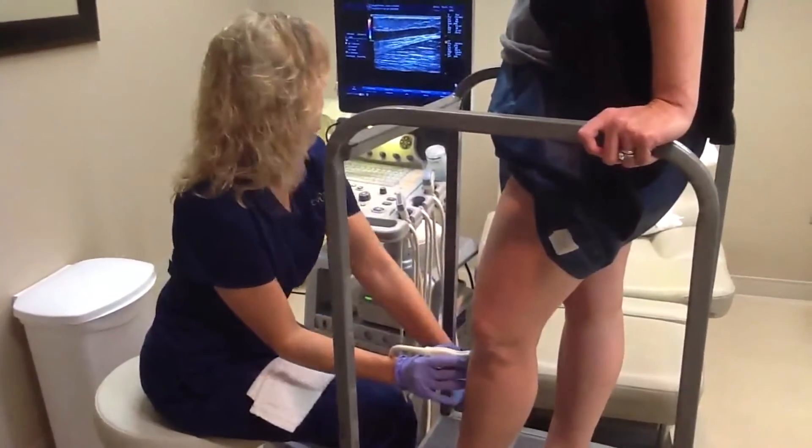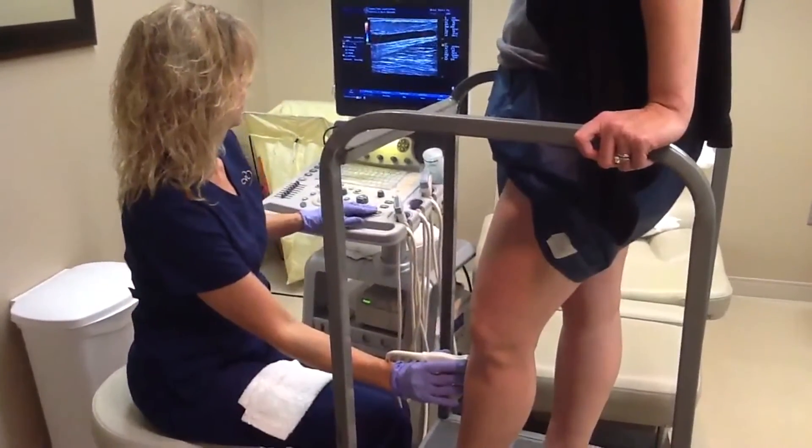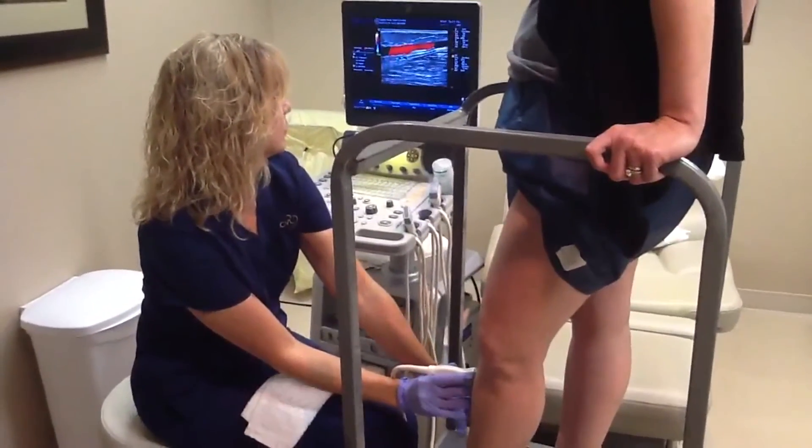Now go ahead, Rochelle, let's take a look at this vein here. The red flow there on the screen shows that that's a vein that has reflux, or backflow.